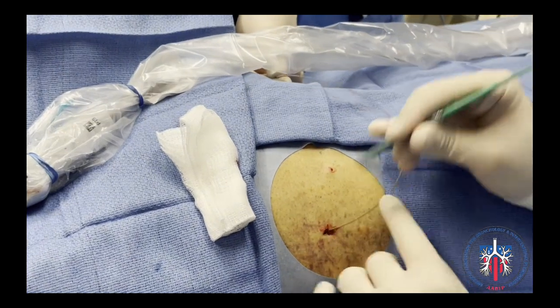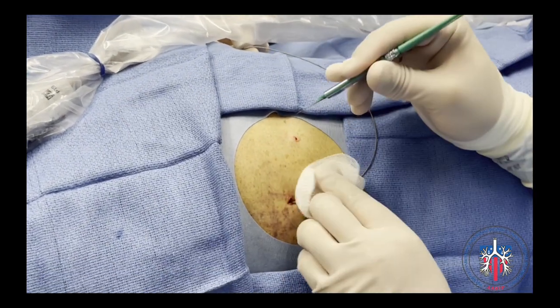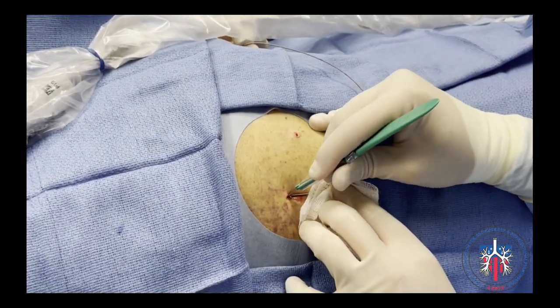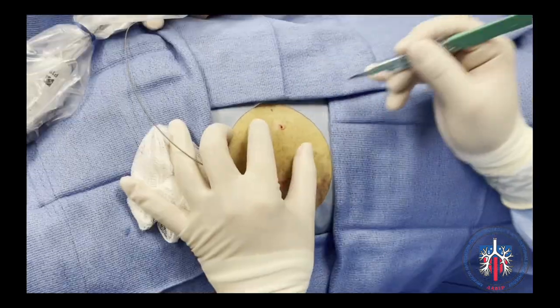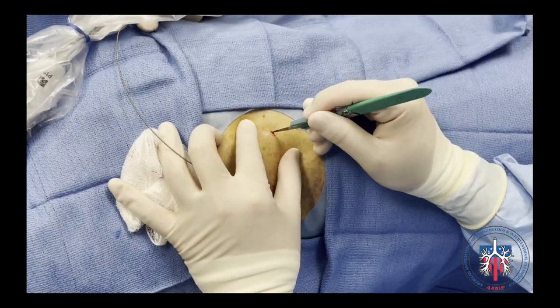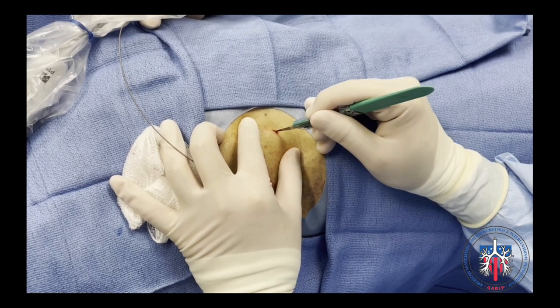Next, with the scalpel, 1 cm incisions are made at the entry and exit points. Of note, the incisions should be made above and below the wire and not against the wire. These incisions should be deep enough to appreciate subcutaneous fat.